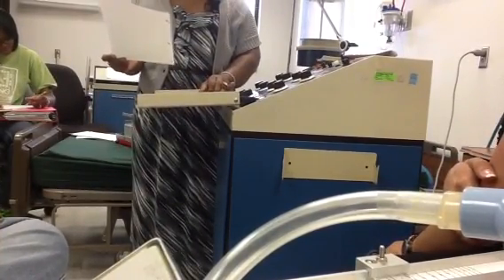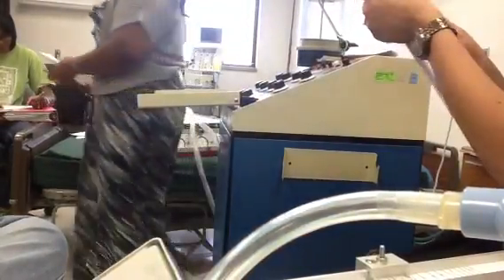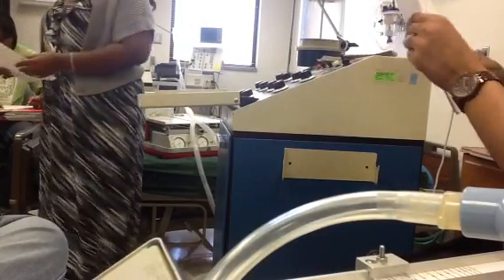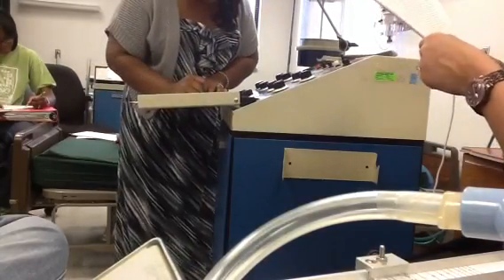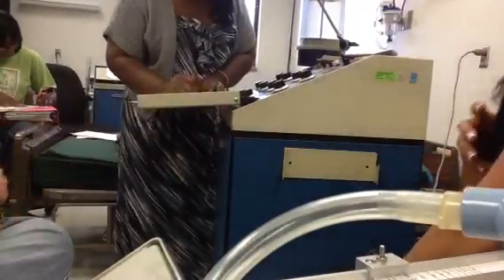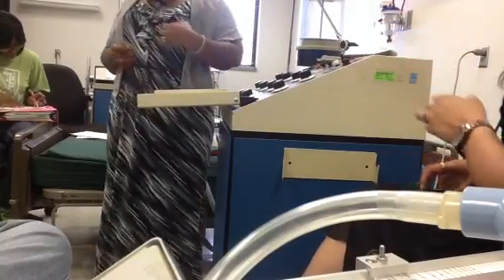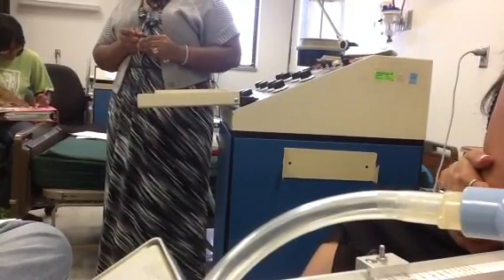Measured goes from tidal volume on down. That part is set, and from measured, airway resistance is parameters you get off your patient, and the rest is alarms. Those are going to be three constant sections in all your charting sheets. So all machines will be similar, but they'll have different charting sheets.